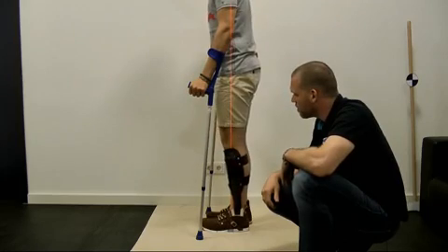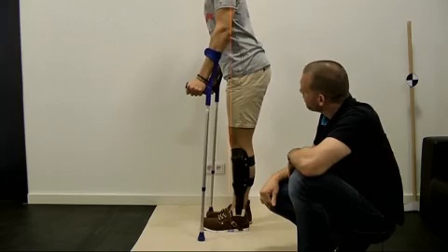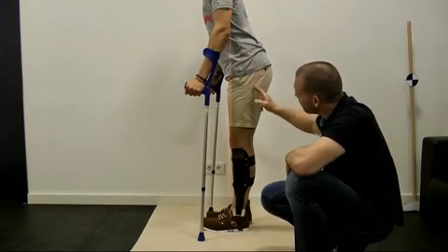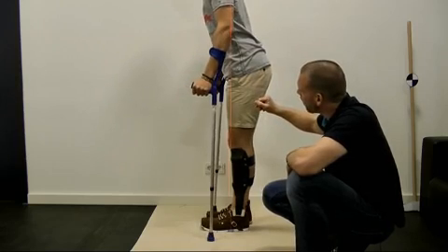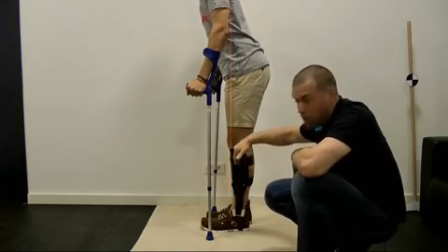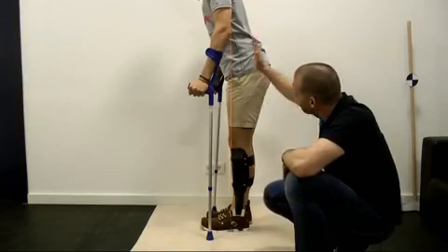Another position that we observe is when patients have hip flexion contractures. In this case, the tibia is not in a physiological inclination. The upper body is forced to move forward, while the buttocks are stretched backwards to achieve some stability over the supporting area.